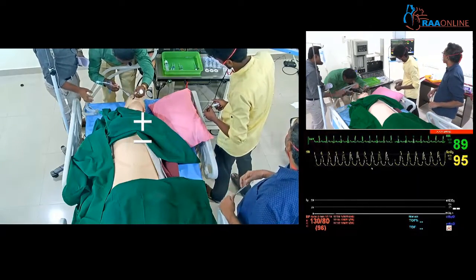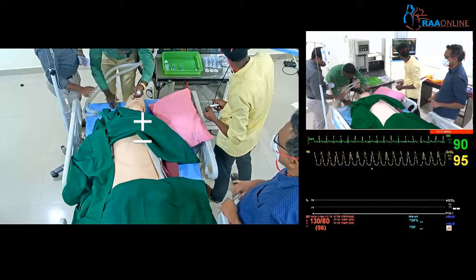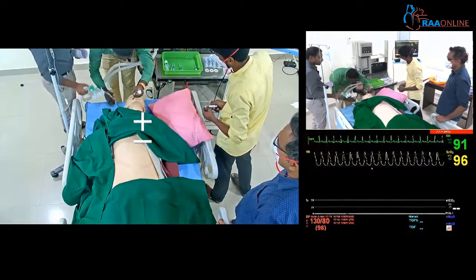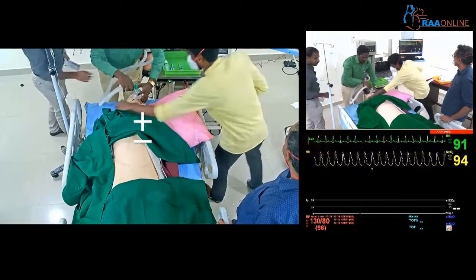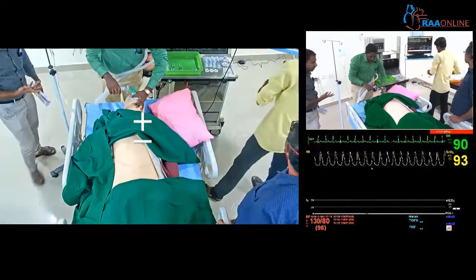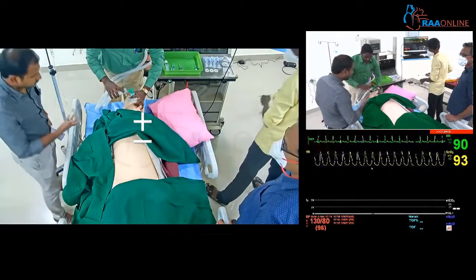Are you able to? No, sir. Not able to. Take out the scope. Just mask ventilate again. Okay, sir. Take out the scope. So now we will optimize the positioning. See, the patient is not positioned properly. Okay, sir. You have not given the proper neck flexion. So give neck flexion.